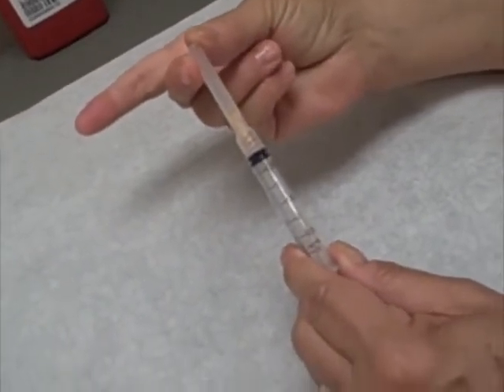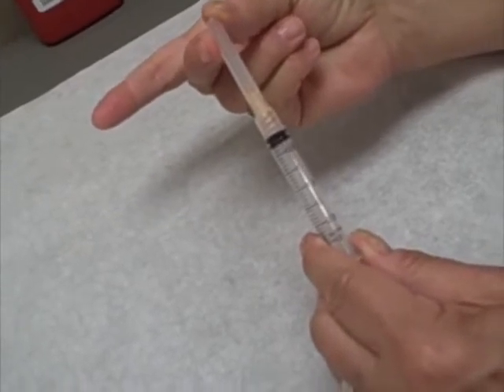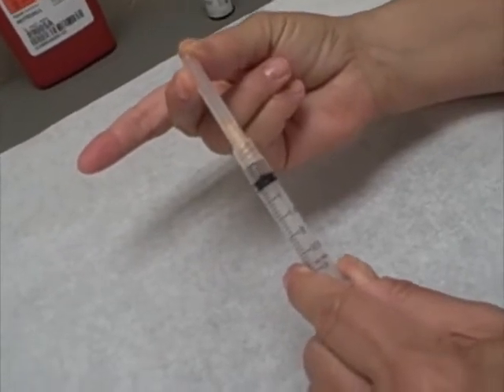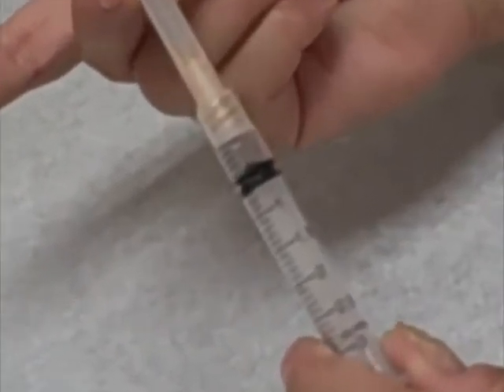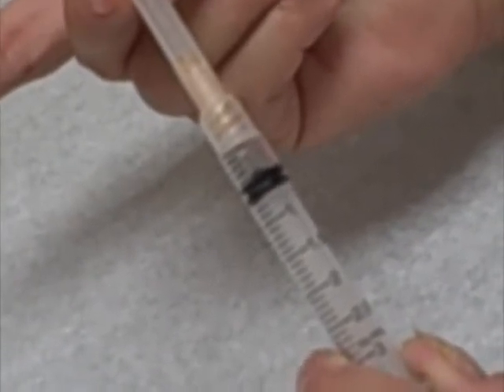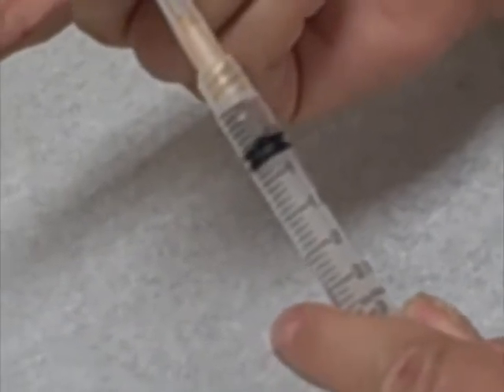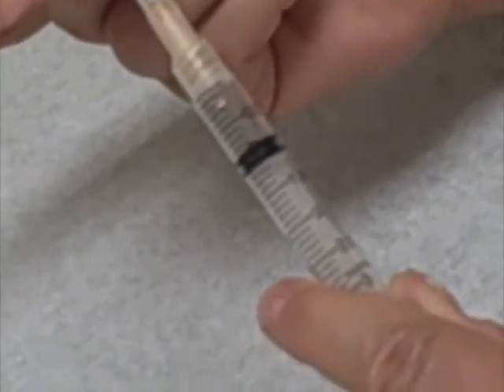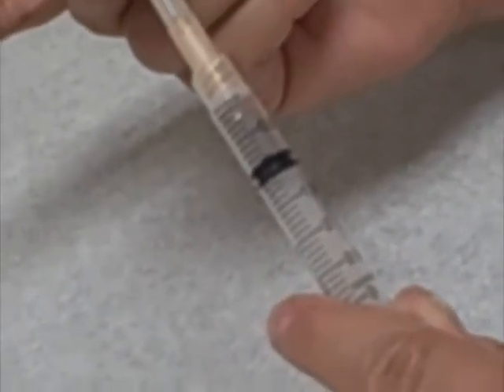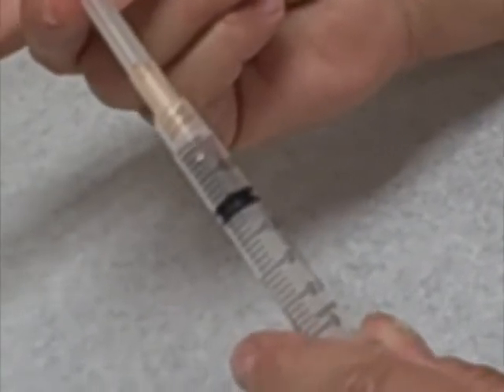So you may not be familiar with this, and it will be consistent with the dose that your doctor prescribes. So if your doctor said take half an ml, that's really at the 0.5 mark. Now notice how when I pull back to that marking, I am lining up the bottom of the plunger that's closest to the needle. So let me pull it back a little more, and now I'm at the 1 ml mark. The doctor may prescribe the medicine in mLs or cc's, and you could probably clarify it also with the pharmacist if you're not sure.